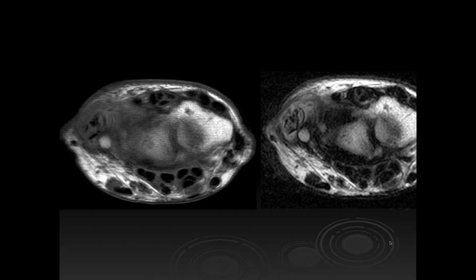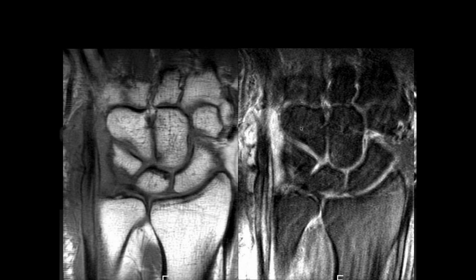All right, so it's kind of marked synovial thickening. It doesn't look exactly like fluid involving that extensor tendon. I'm trying to... Is it going to be the ECU? And I'm just trying to look at the tendon itself, if there are longitudinal split tears within, or if it's just severely tendinotic. But it's just marked tenosynovitis of the ECU. But I think it's grossly intact.